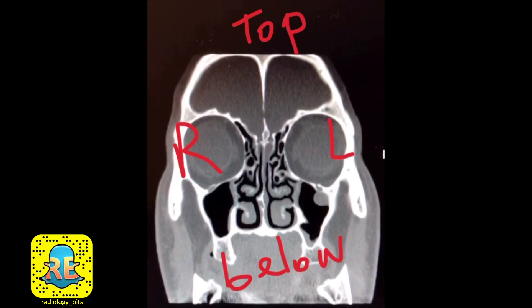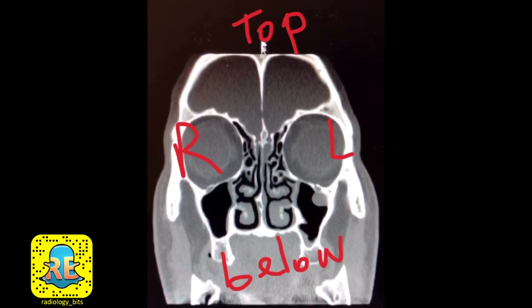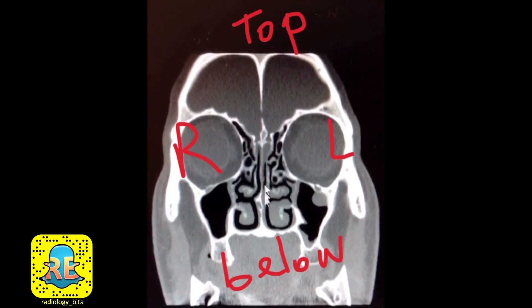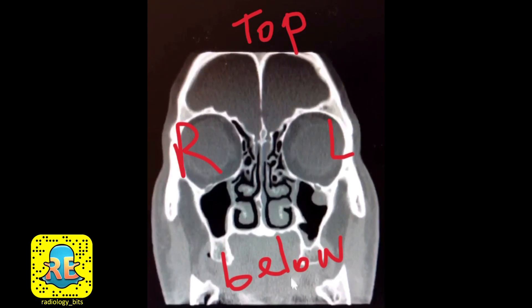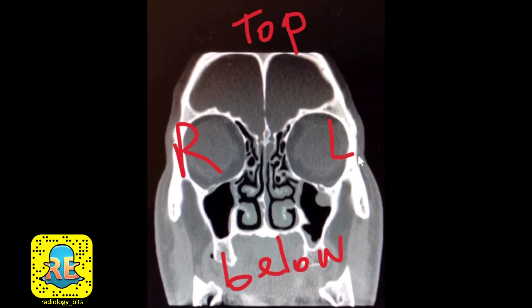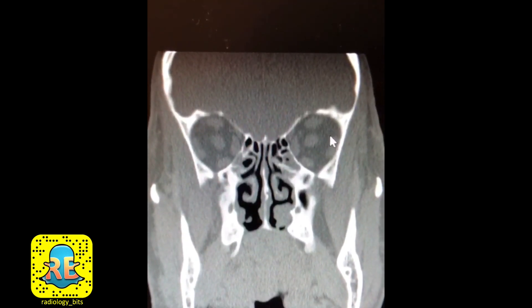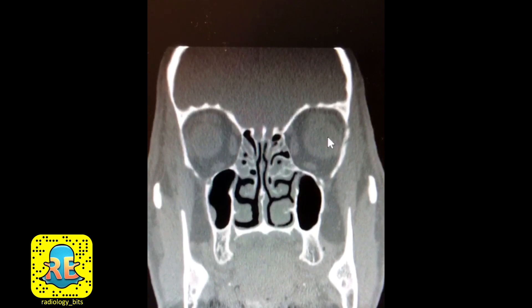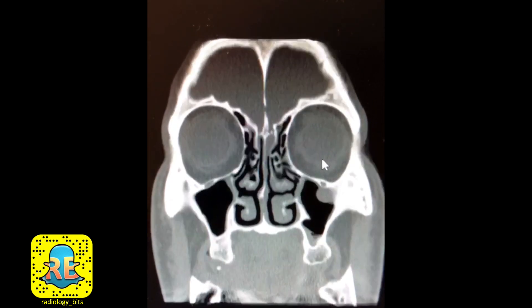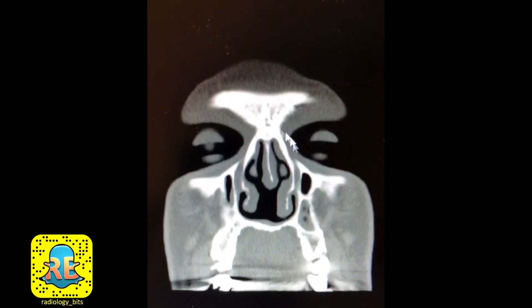Now this is the same patient. We're looking at a coronal image, meaning this is the patient's top or head, this is below or inferior, this is right and this is left. We're going through the images from posterior to anterior, from back to front, as you see the orbits and the nasal cavity here.